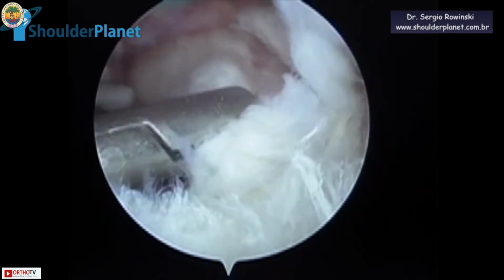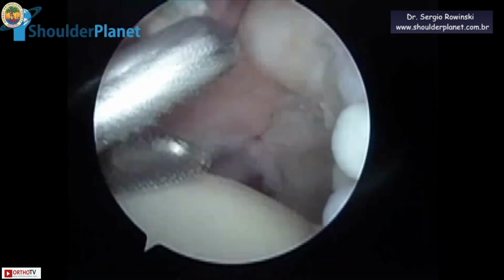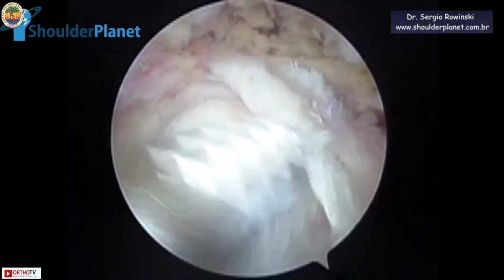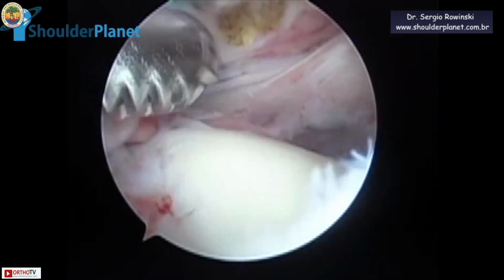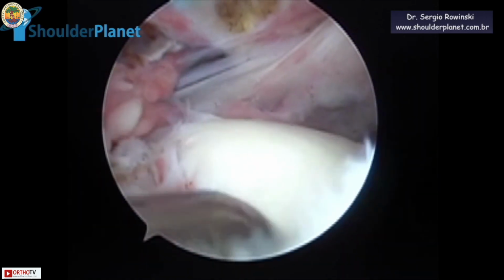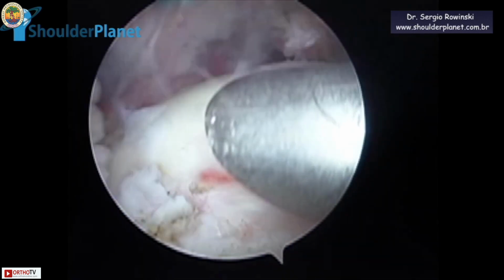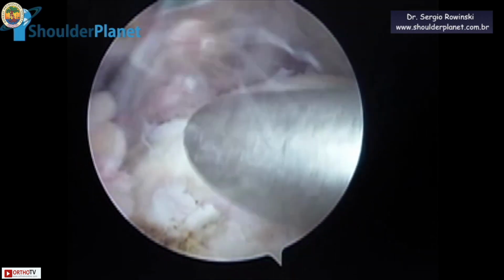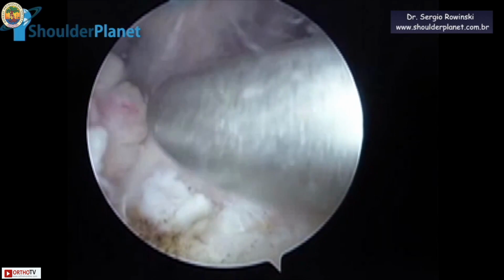So we performed a very simple and fast debridement of the edges of the lesion. This is what we are doing now. And then we started to medialize the footprint. We entered with a soft tissue shaver to clean the greater tuberosity through the anterosuperolateral portal. Then through the posterior portal, we entered with the burr, and very gently, very softly, we started to create a new bony bed.